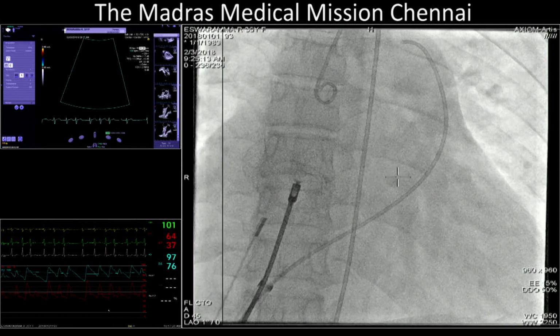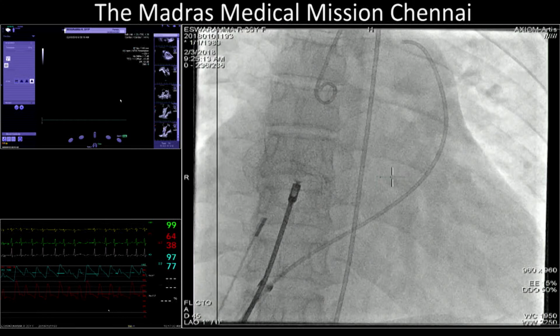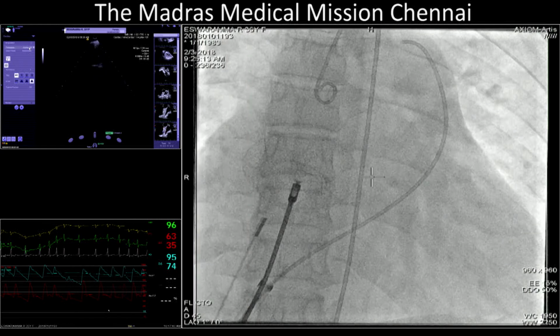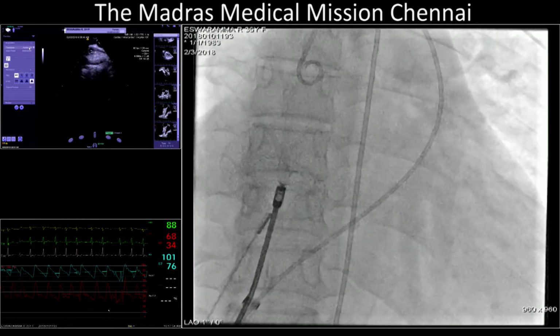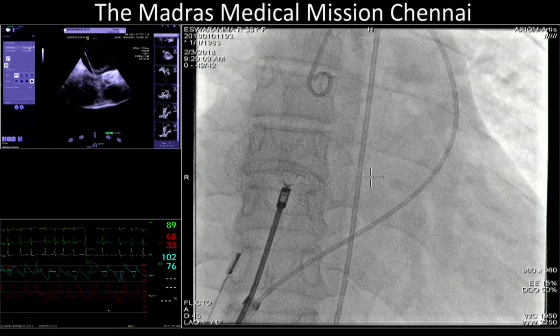Very quickly, Hujjat Murtazia has a comment or a question. Is it possible to do a contrast echo now to show the left to right or right to left shunt? Well, they can see that on color at the moment. On color it is left to right shunting. With a sheath, if you do a bubble study where the sheath is, you'll have some right to left shunting because it's directed at the fenestration. And with the color, it's a pure left to right shunt.